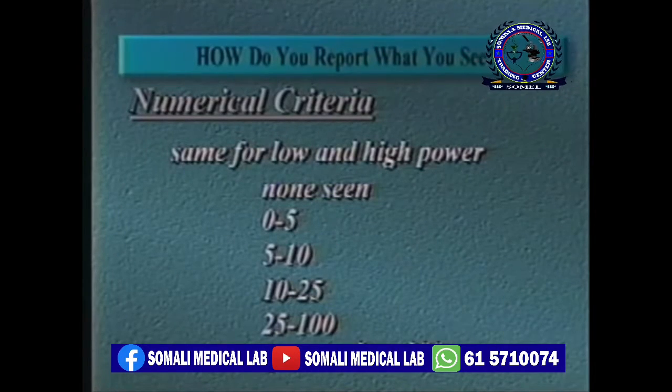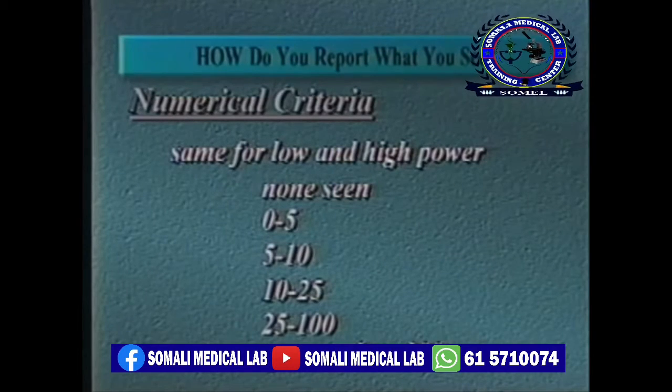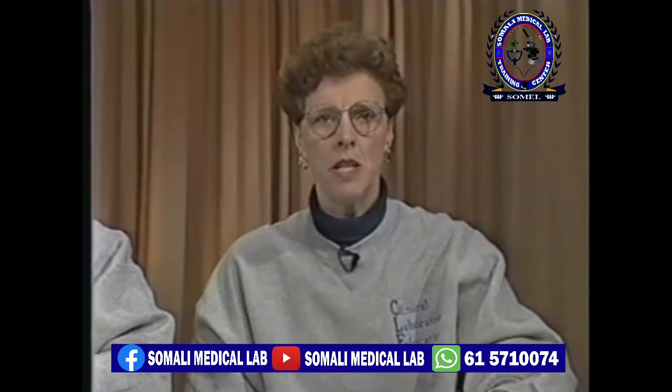This grading system is used for casts under low power and red blood cells, white blood cells, and epithelial cells under high power. Here's an example of how it works. If this were one microscopic field and all 10 fields looked identical, you would report 10 to 25 red blood cells per high power field. There are definitely 12 red blood cells in this field, with a couple of questionables, which could be confirmed with fine adjustment.